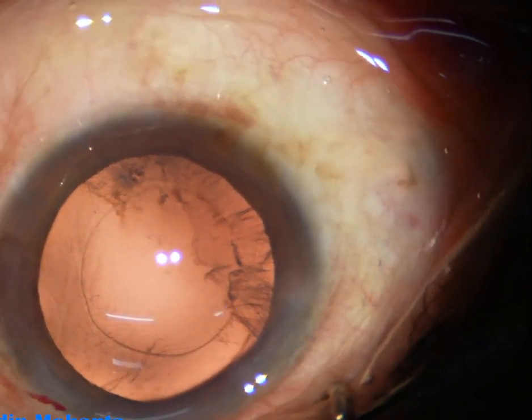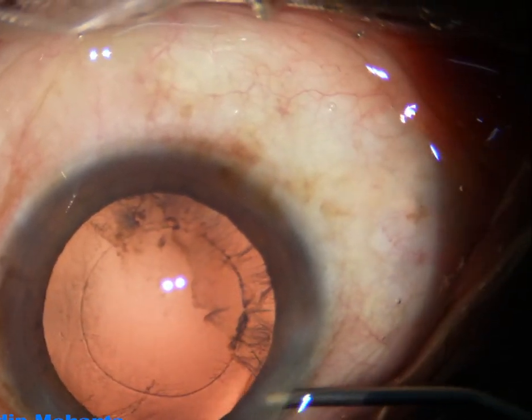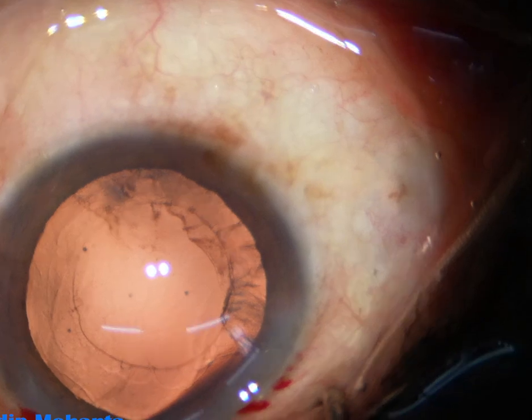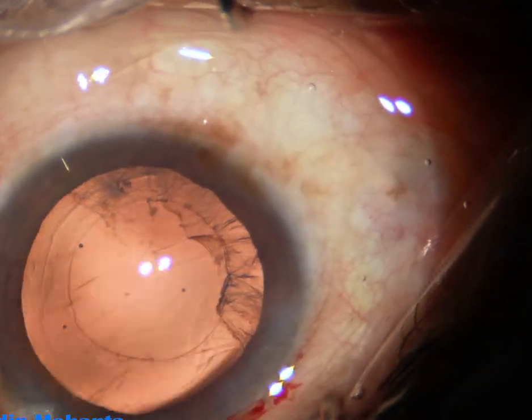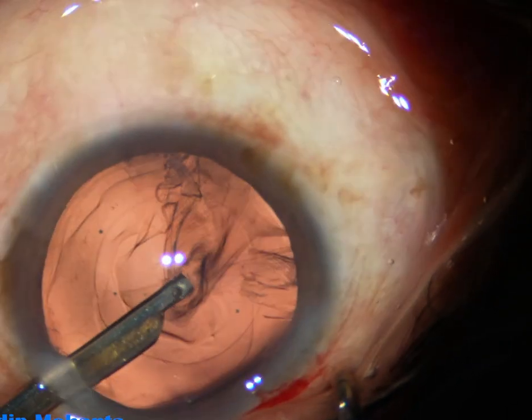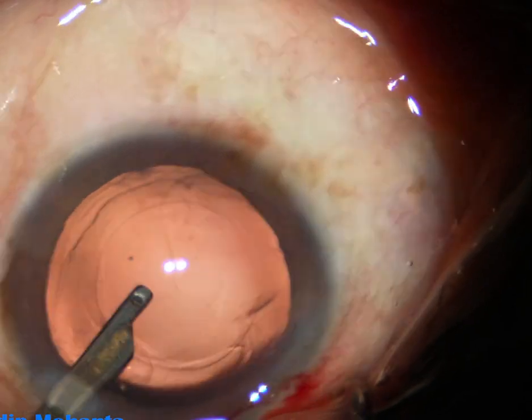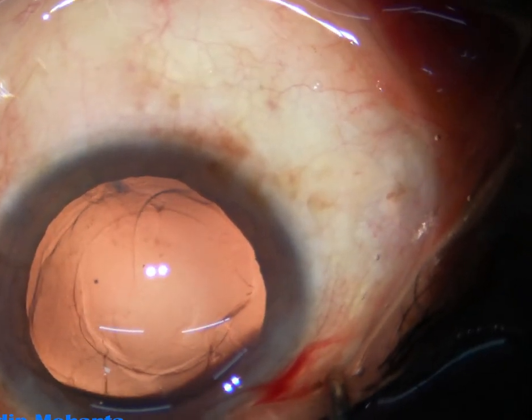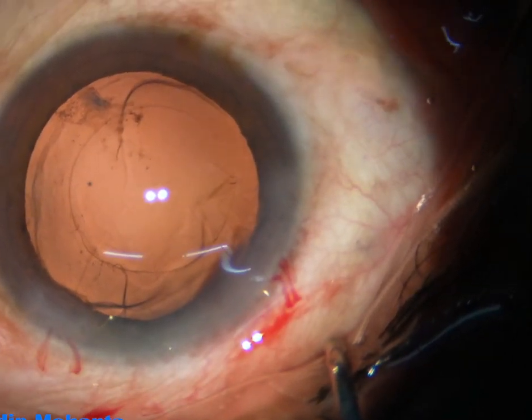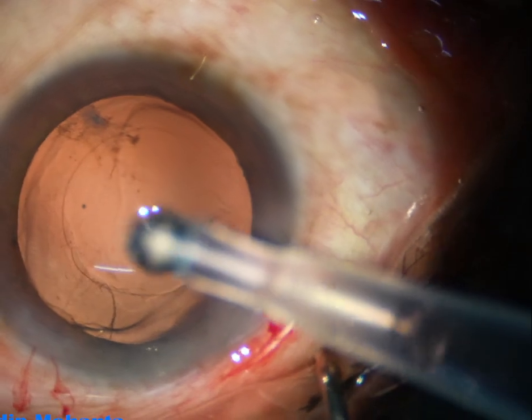Now I use 2% hydroxypropylmethylcellulose again to fill up the anterior chamber and the capsular bag. A 23 gauge Simcoe is used to remove the rest of the cortical matter. The Simcoe is a very nice instrument — through the side port, a coaxial I/A cannot go, but a 23 gauge Simcoe can go through a 1.7 mm wound.